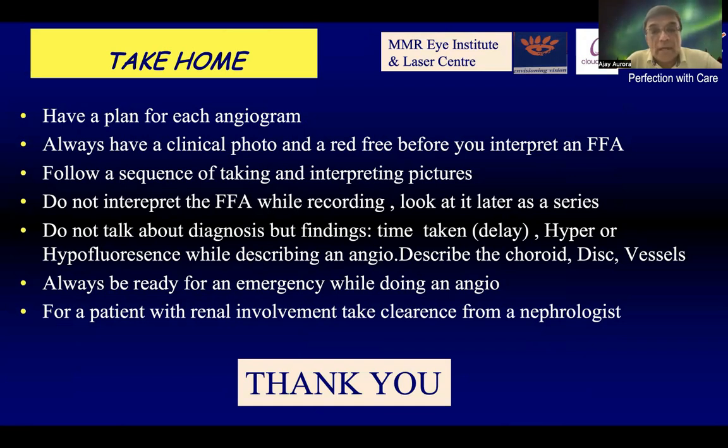Do not talk about the diagnosis, but only look at the findings, the time taken, the delay, the hyper or hypofluorescence. While describing an angiography, you must describe the choroid, disc, and vessels also. Always be ready for an emergency while doing an angio, and for the patient with a renal involvement, take clearance from the nephrologist.